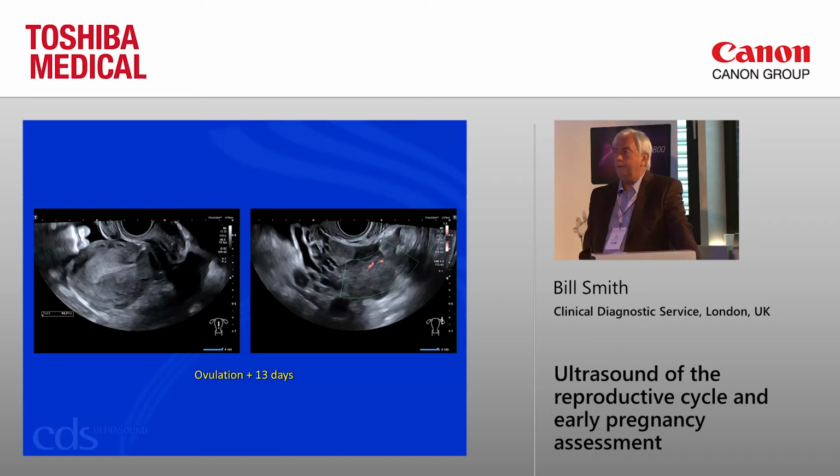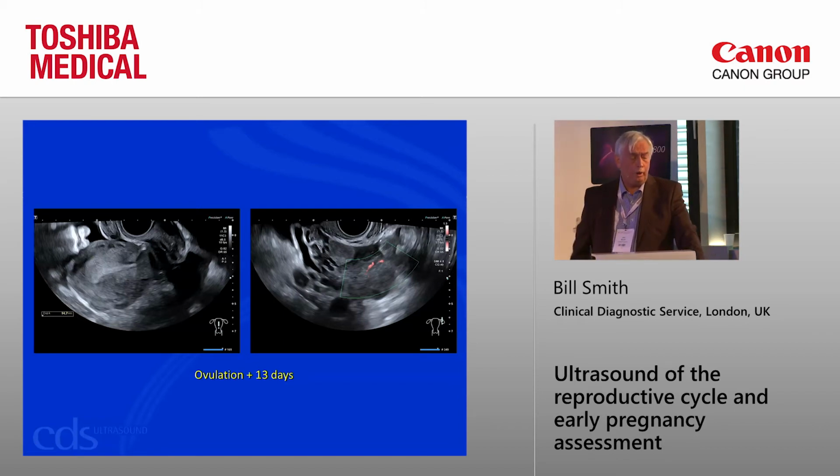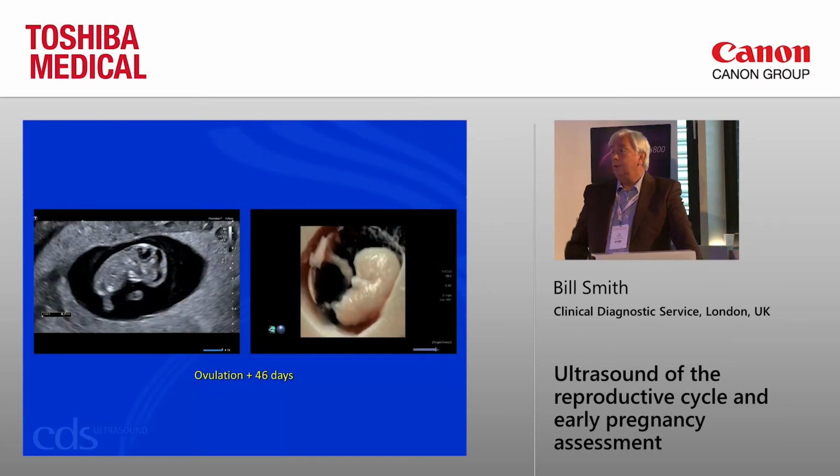And certainly the clinical team that I work with, if we take this example here, where we have an intact, thick endometrium, this is really on the day of the positive pregnancy test, 13 days after ovulation. We look at the ovary here, then obviously there's a clot-filled corpus luteum there, which is obviously difficult to see on the grayscale, but there's poor peripheral vascularity. So we would give that patient progesterone. And this is that patient a few weeks later.